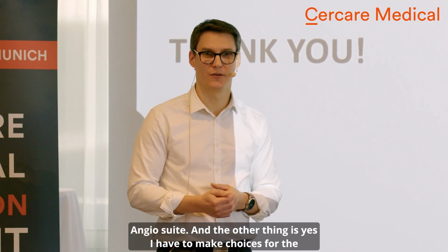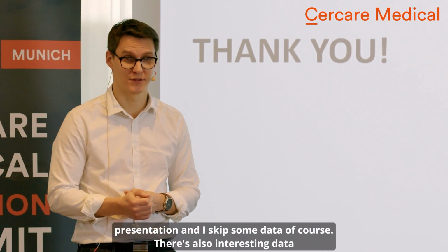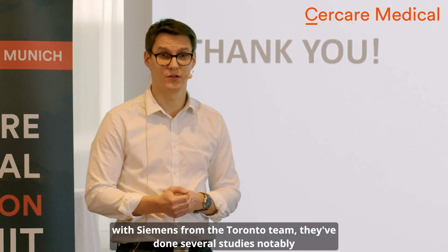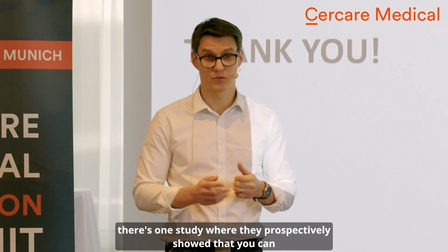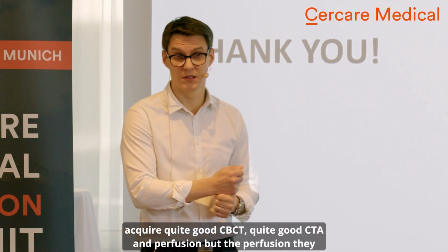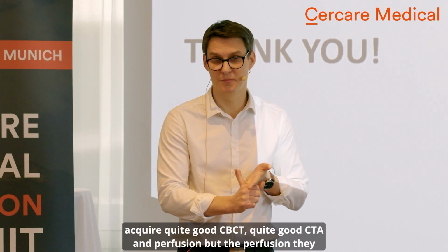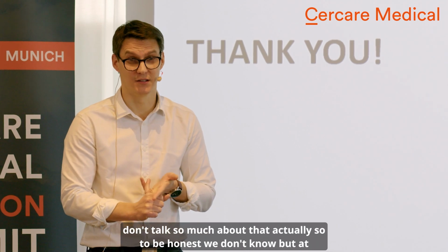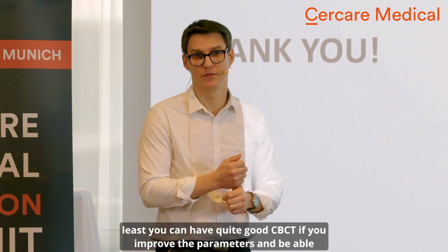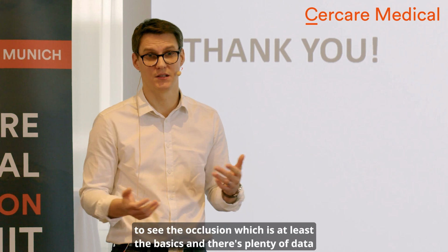And the other thing is, yes, I have to make choices for the presentation, and I skip some data, of course. There's also interesting data with Siemens from the Toronto team. They've done several studies. Notably, there's one study where they prospectively showed that you can acquire quite good CBCT, quite good CTA, and perfusion, but the perfusion, they don't talk so much about that actually. So to be honest, we don't know, but at least you can have quite good CBCT if you improve the parameters and be able to see the occlusion, which is at least the basics.